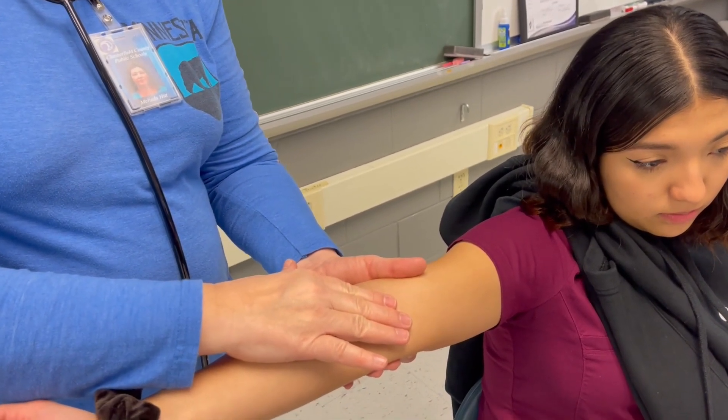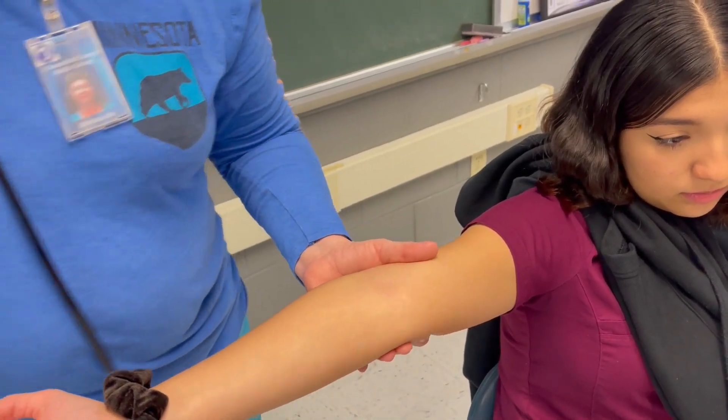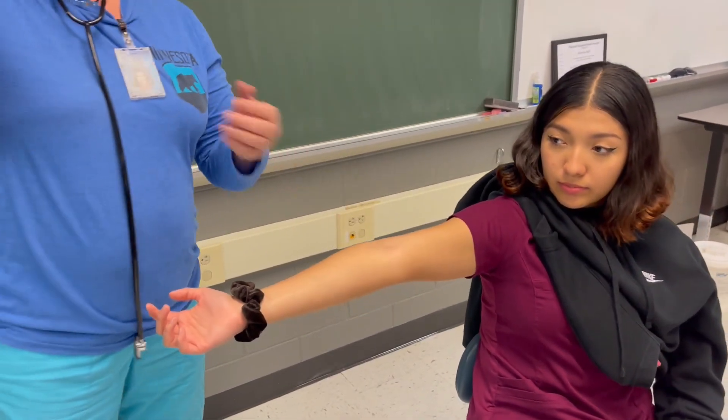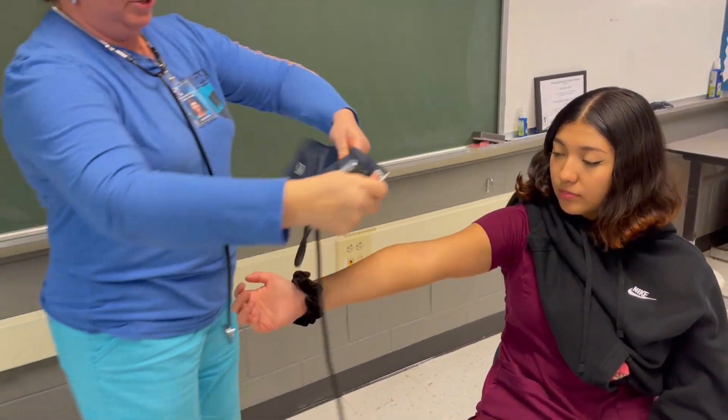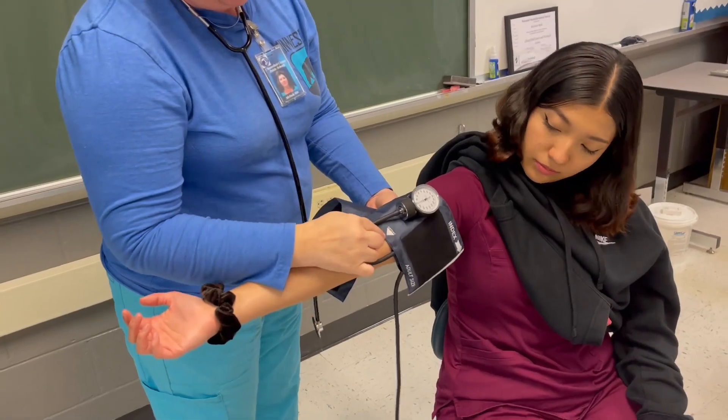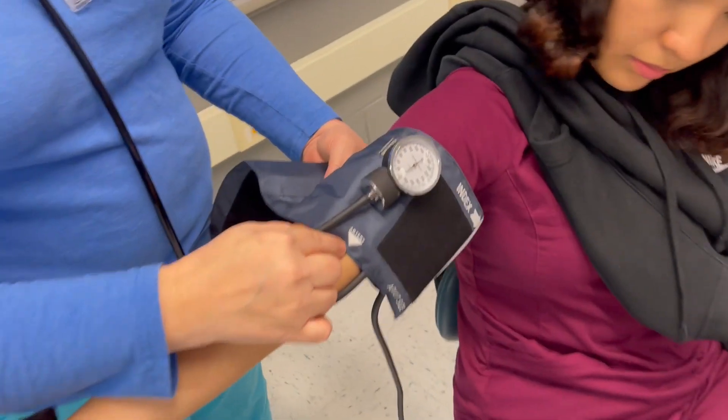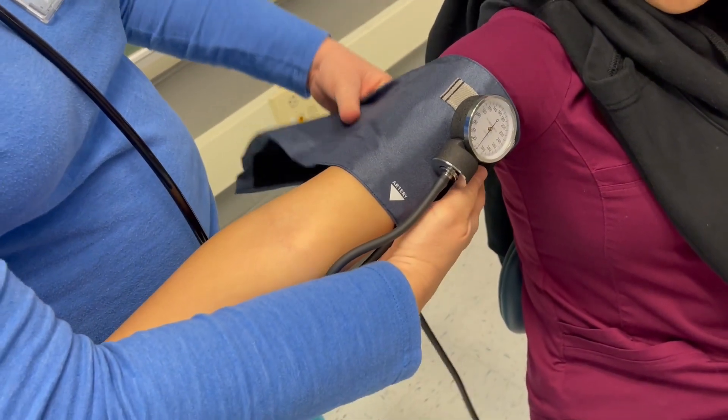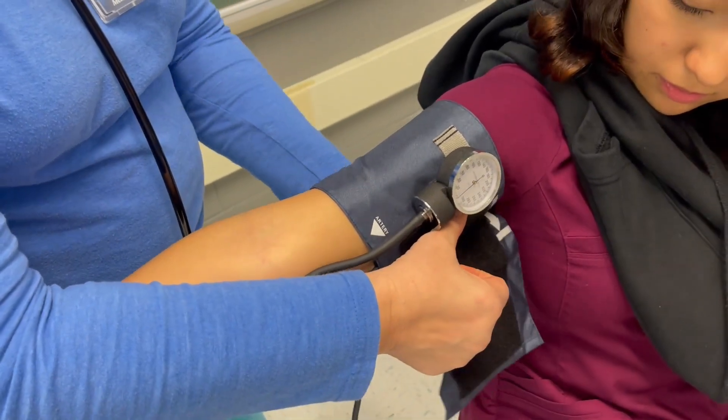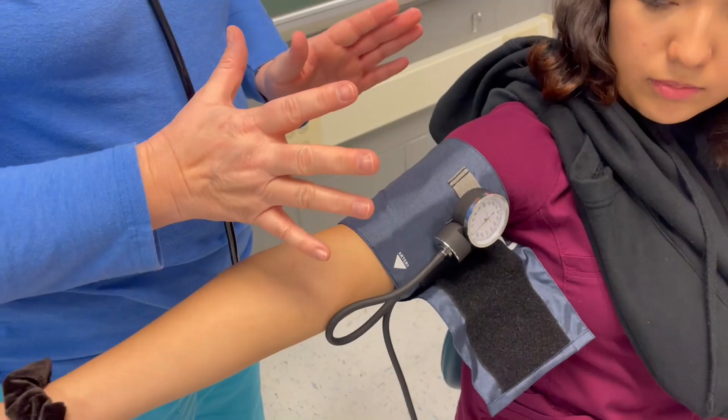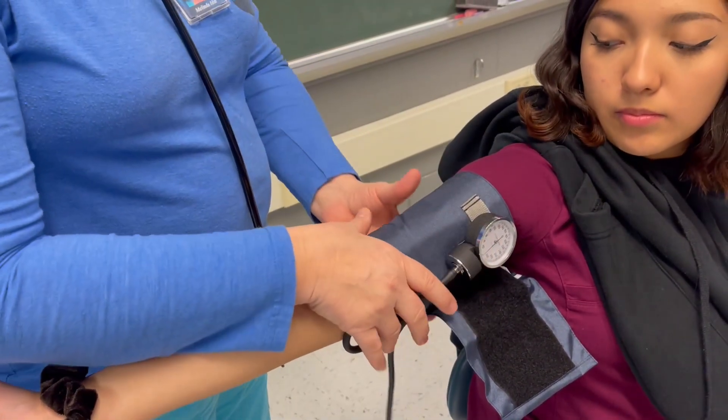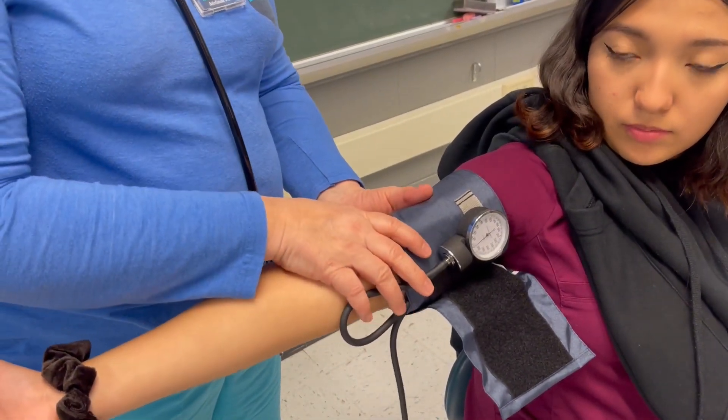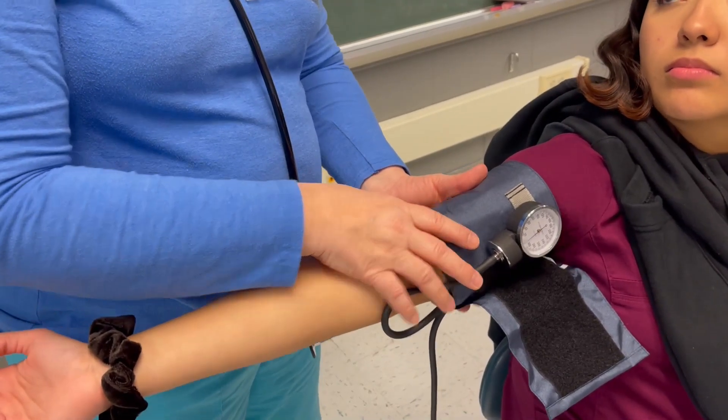So, you're just going to hold it, find it, and then when I go to put the blood pressure cuff on, you see it says artery. So, you line it up, and you put it on, but not too tight, and not where it can wiggle around. You just want it to fit kind of like a pair of yoga pants, where you feel secure.